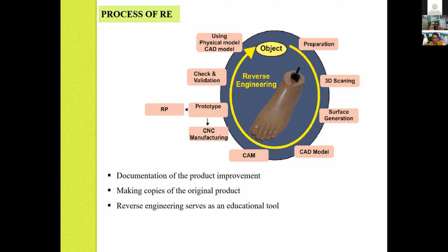So you make some copies. Okay, so that your implant or things are available to you directly to use, not by making a product for each and every person. Okay, so definitely it is a little bit generic, so the cost will be low. So we can create some educational tools for dental surgeons. We will create different kinds of models for educating them, even for surgical purposes.